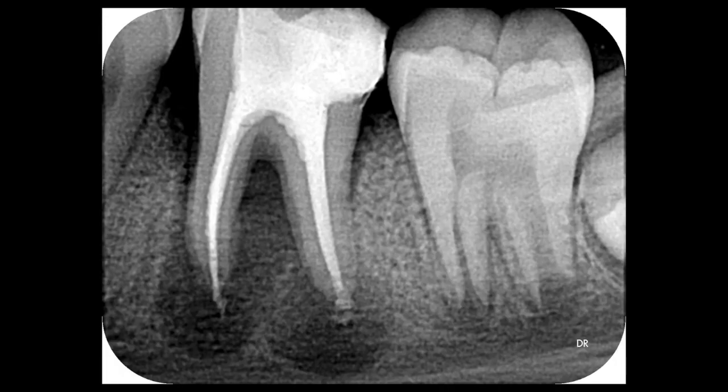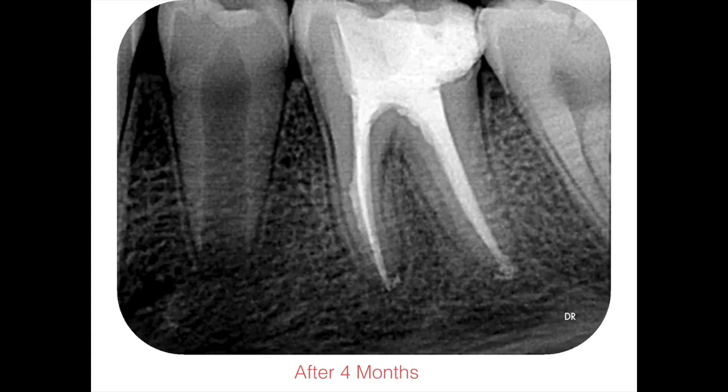After injecting the sealer, smaller-size cones were placed, a GI restoration was placed, and the patient was sent home. This is the immediate post-obturation radiograph. As you can see, the canals filled all the way to the apex, with a small puff of material out the end of the canals — but that's not a problem since the material is very biocompatible. Because of the mobility, the tooth was also splinted to the second molar afterwards.